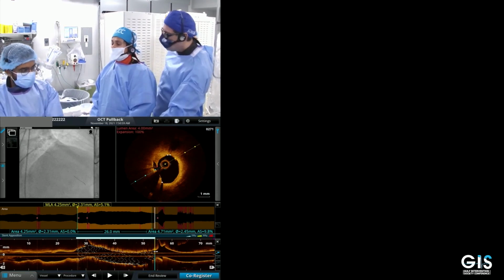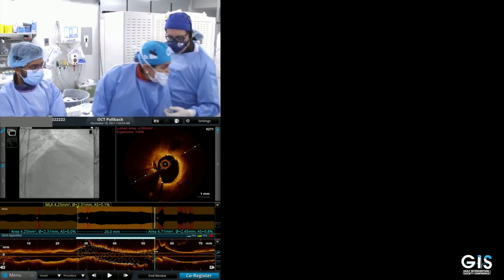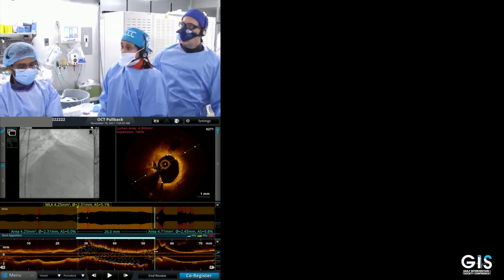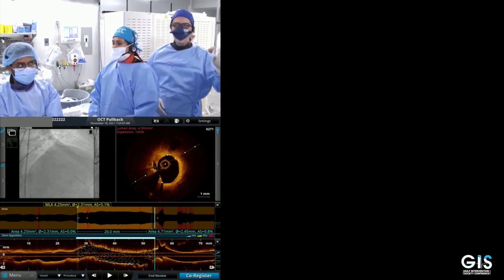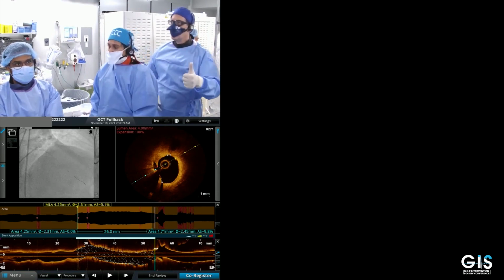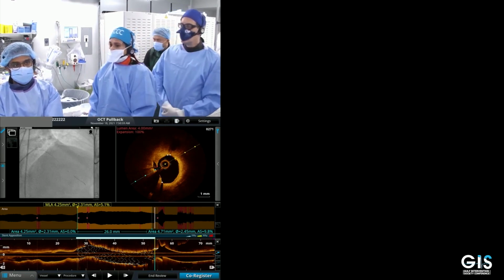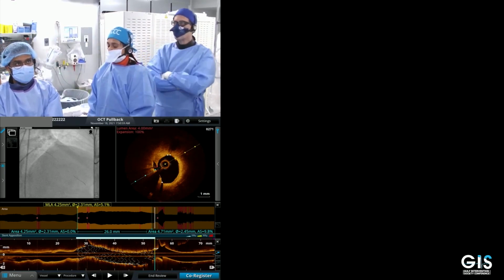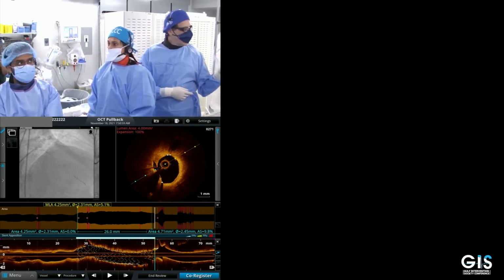Talk about antiplatelets, as has been mentioned nicely by everyone. So what about antiplatelets now? Are we going to do a POT or not? No, we don't need to do a POT. The sizing, we saw, George, that based on the OCT, the missing point is the vessel sizing. The stent was well opposed. We're all done, so no need for POT. We're all done. This was the final pictures. Yes, I agree completely.